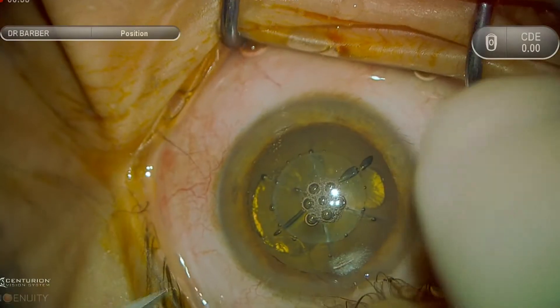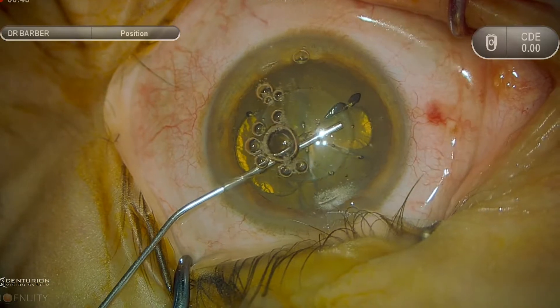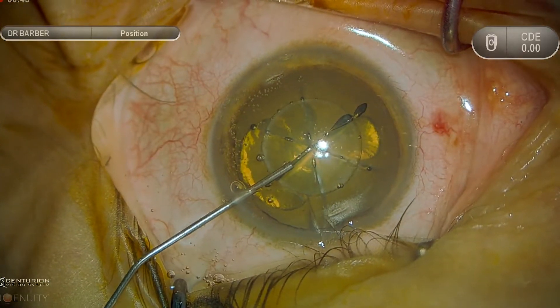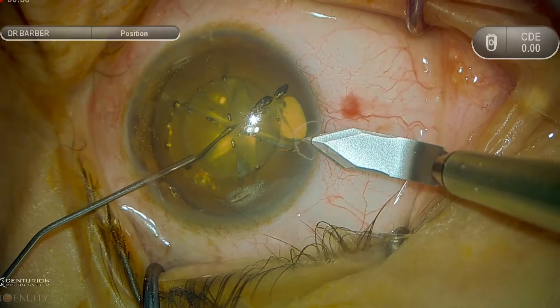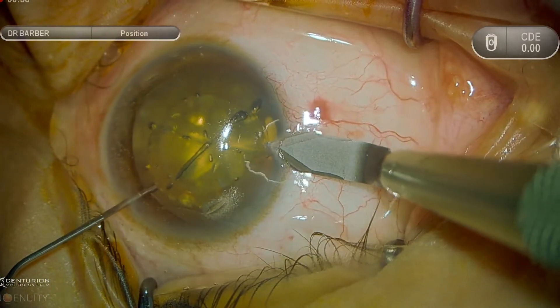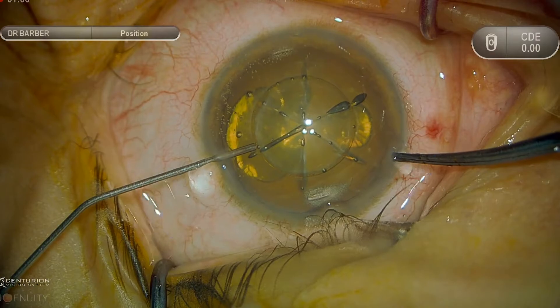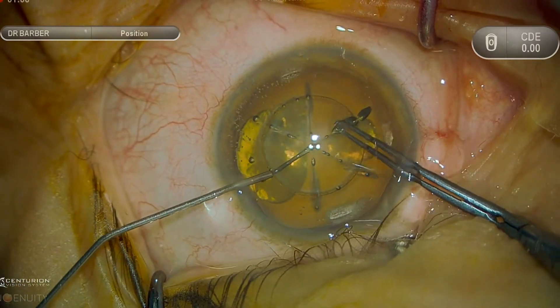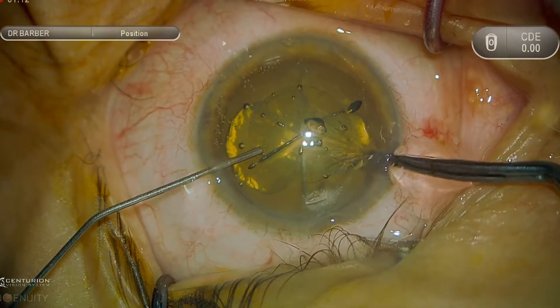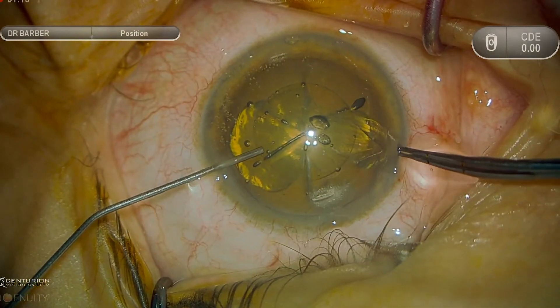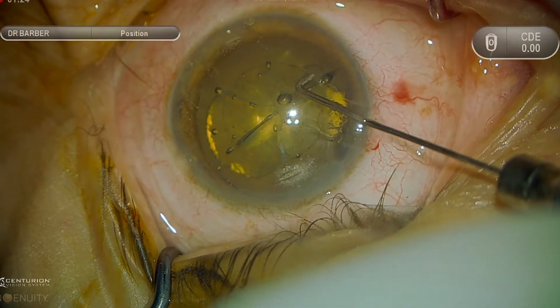This is a case of femtosecond laser-assisted cataract surgery using phacoemulsification in a patient with dense asteroid hyalosis. This 2.4 mm clear corneal incision was just created, and the anterior capsular remnant created by the femtosecond laser is removed. Hydrodissection is gently performed.